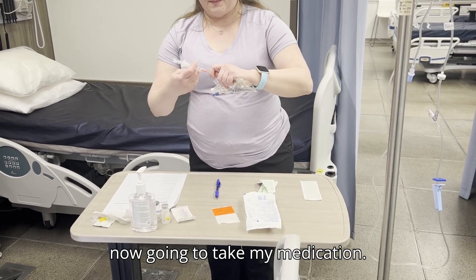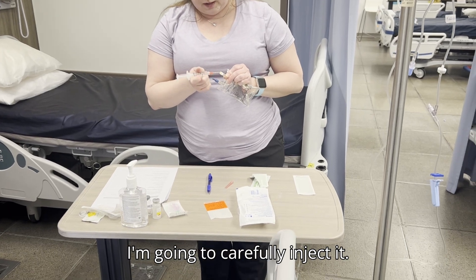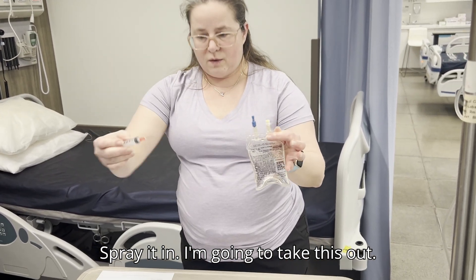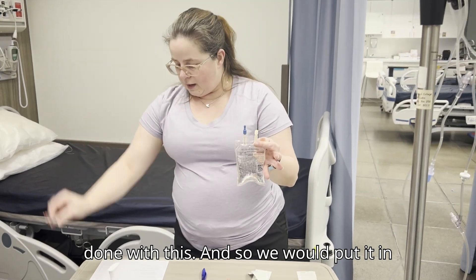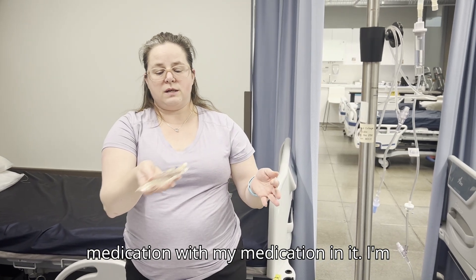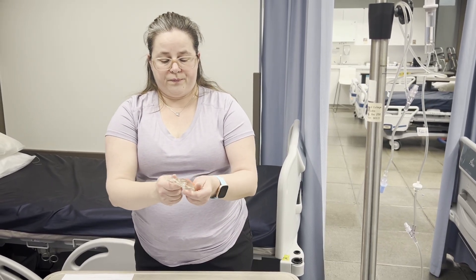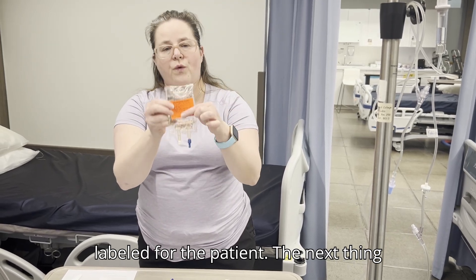The start time is generally the same time as you're preparing it. Now I have my label ready. I'm going to carefully inject the medication into the mini bag, then remove the syringe — at this point I would no longer recap it; it goes straight into the sharps container. Now I have the medication in the mini bag, give it a brief shake, and then label it. The bag is now labeled for the patient.